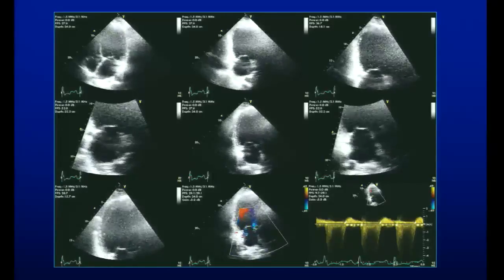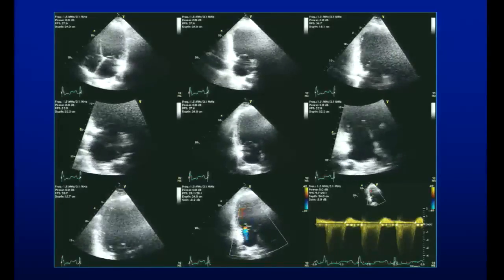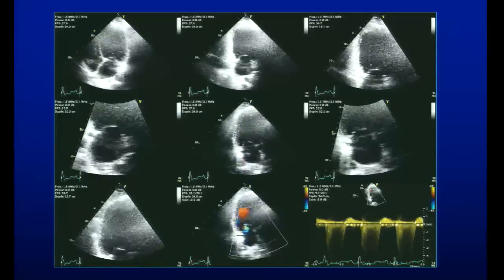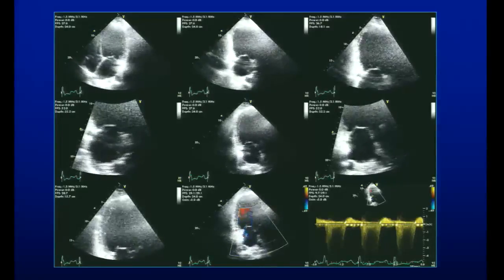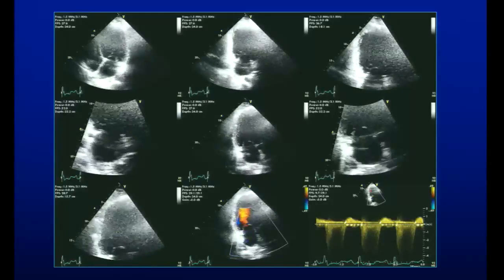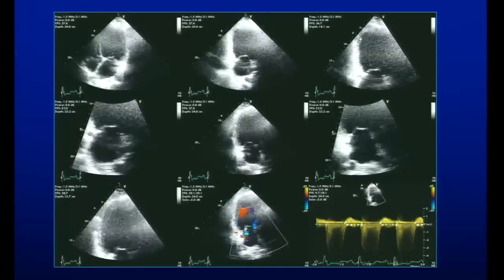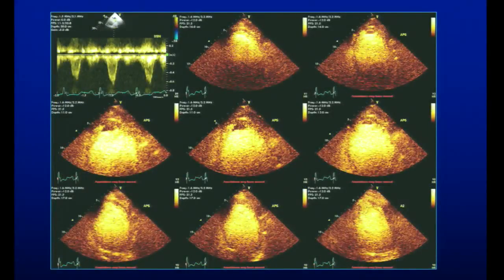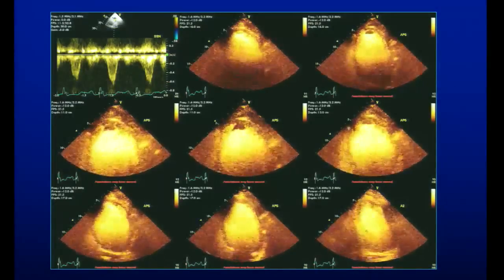The severely depressed ventricle, there's no question about it. The walls that I see are dysfunctional significantly, some akinesis in the inferior wall, apex probably akinetic, basal lateral wall is functioning. So I could say severely depressed function. I have no issues with that. But, you know, the sonographer astutely enough used contrast in this individual.